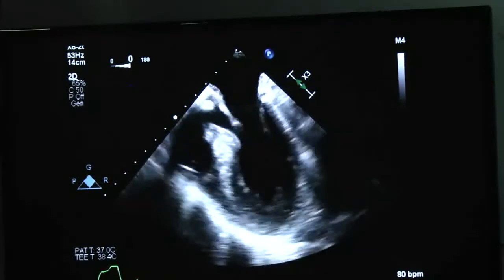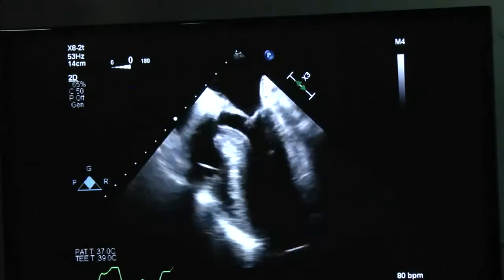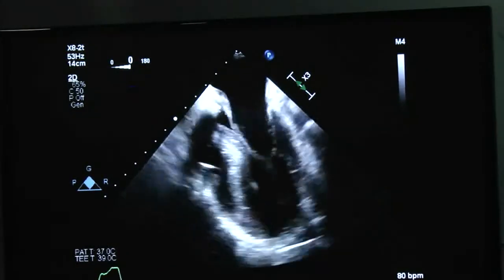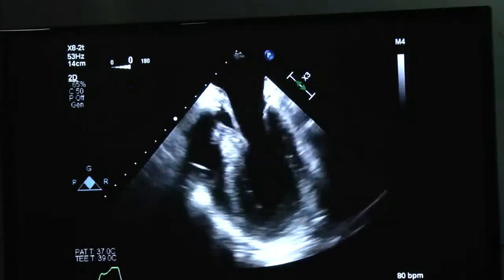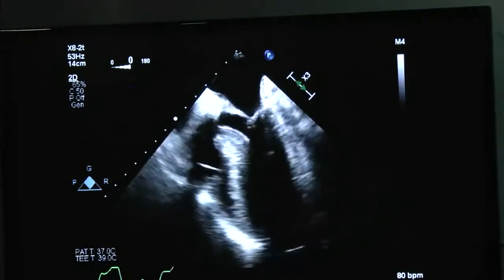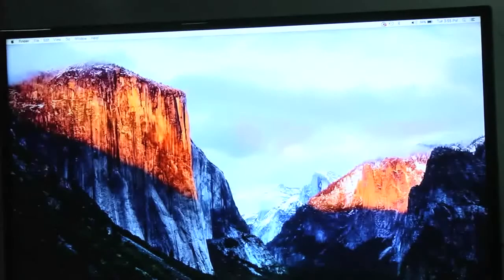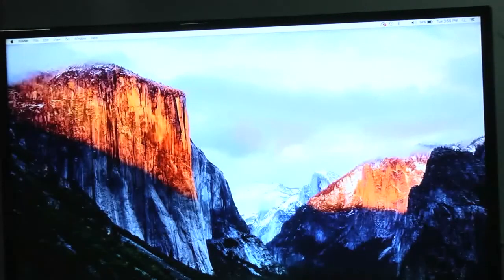You can appreciate part of the anterior mitral leaflet coming into the LV cavity. Measurements showed approximately 0.7 cm — less than 10 mm — with the tip coming closer to the septum and quite a bit of turbulence. This demonstrated a SAM effect post-bypass.